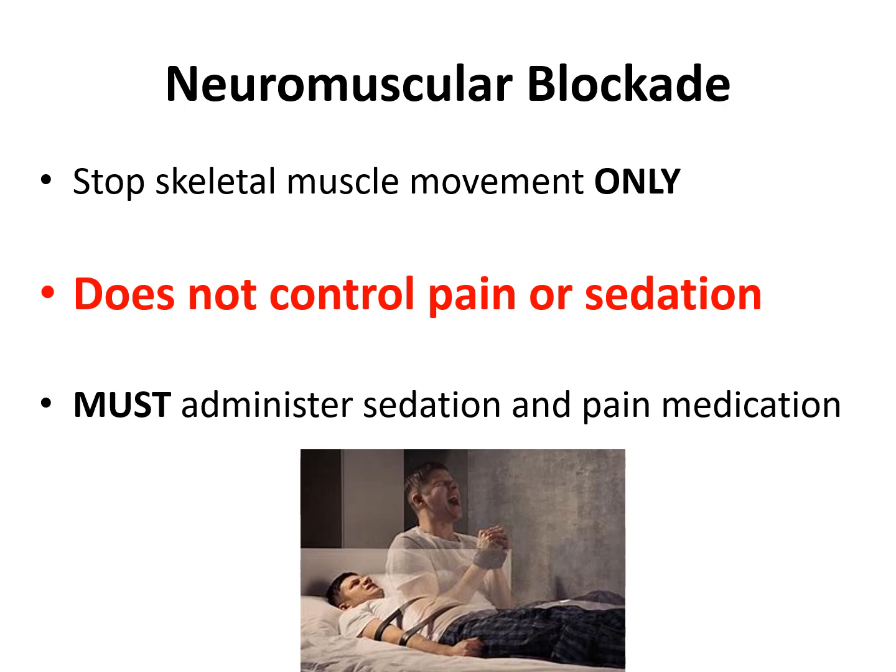When sedation is not enough to decrease spontaneous respirations, neuromuscular paralysis may be necessary to control ventilator synchrony. This will help facilitate oxygenation. And again, you want optimal ventilation as well. You need to be able to oxygenate and ventilate that patient to have adequate oxygen and CO2 exchange.